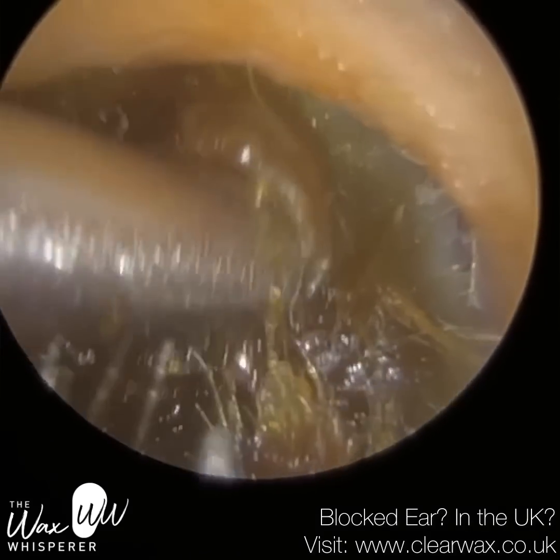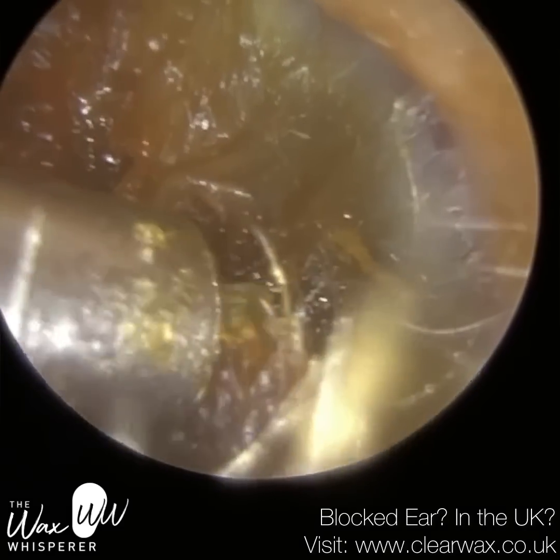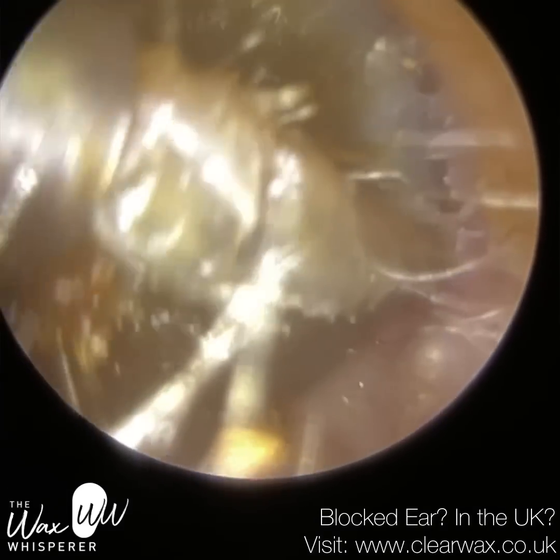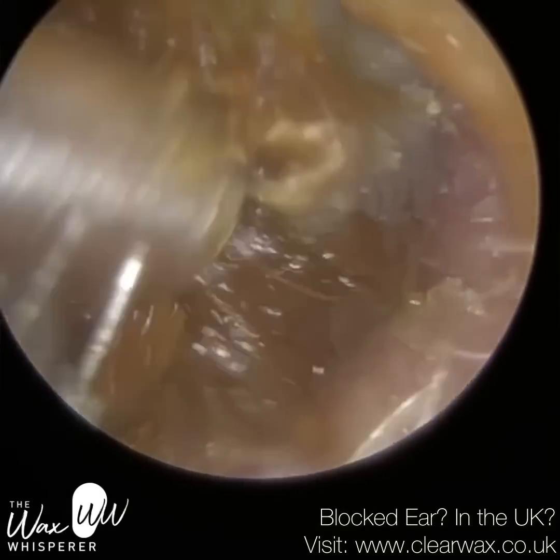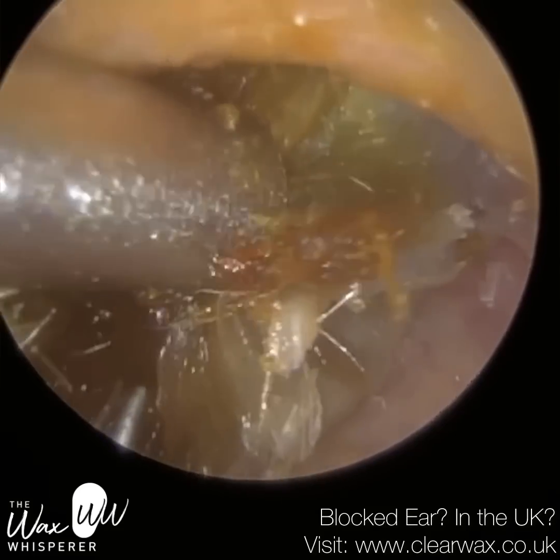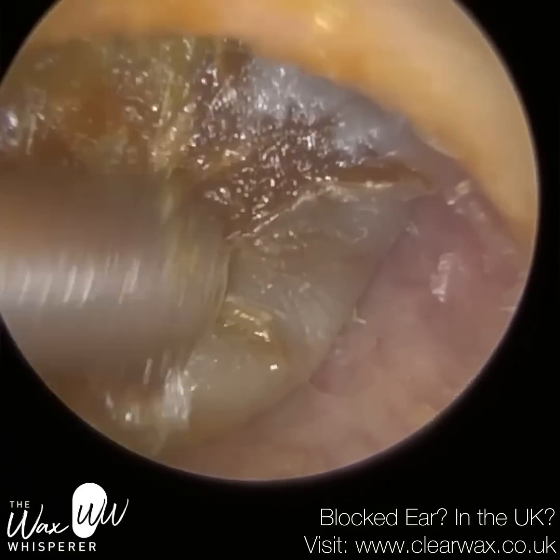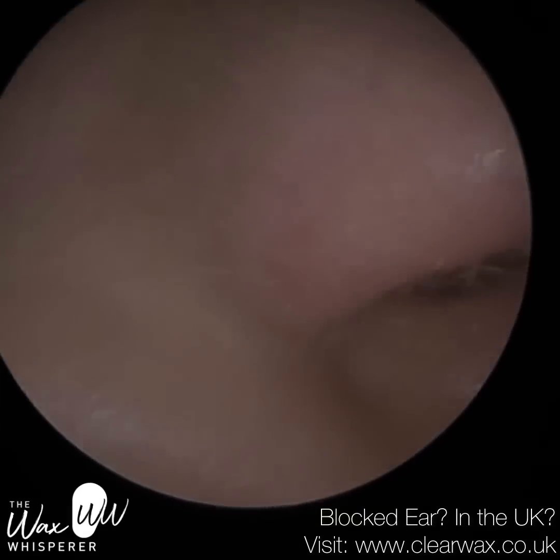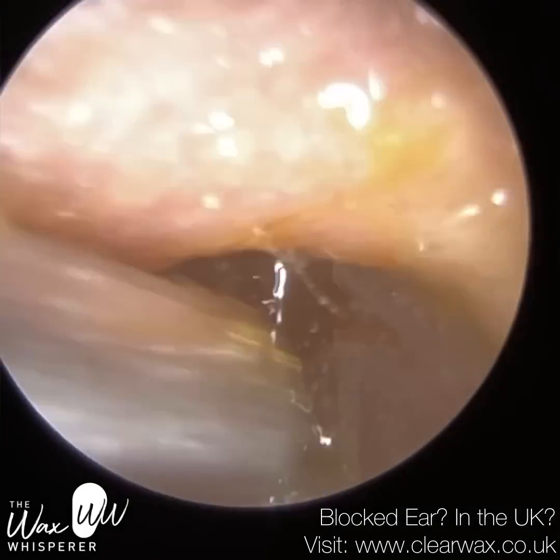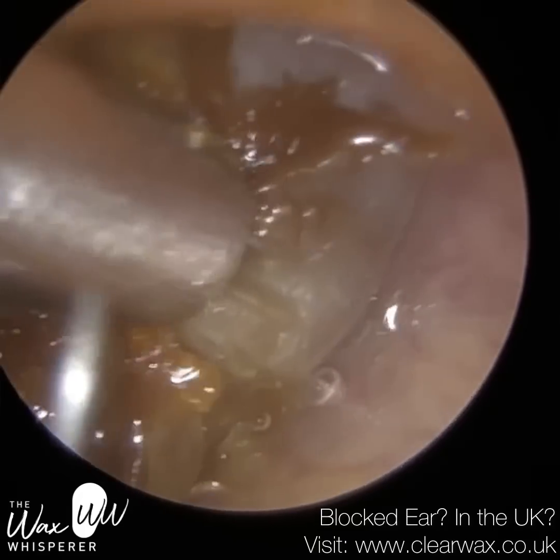And of course, if the wax is near the entrance, you're going to see it. Now, you can get an endoscope with an extremely wide field of view, so even when the endoscope is in the entrance of the ear, the wax looks further away. The problem with that is, although for earwax close to you, you get a good field of view, it may not be as close up, and then the eardrum is so far away from you, because there's a trade-off between field of view, how much periphery you can view, and the magnification. You can't have great magnification and a wide field of view, because the two things contradict each other.